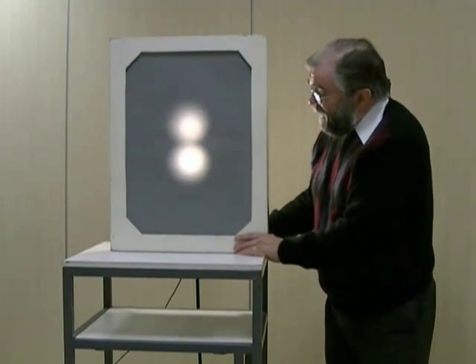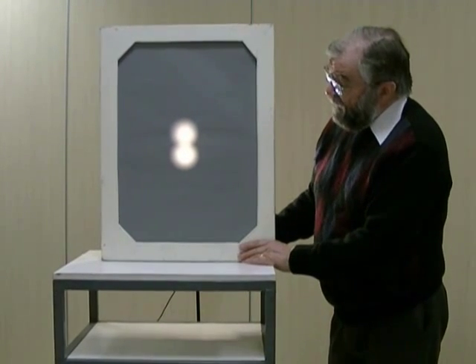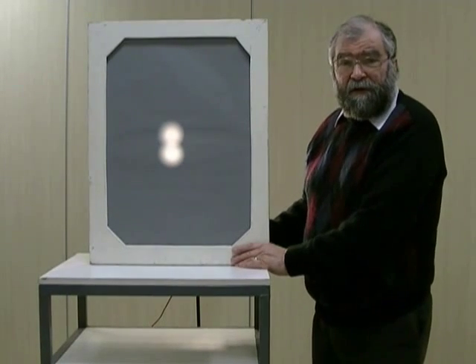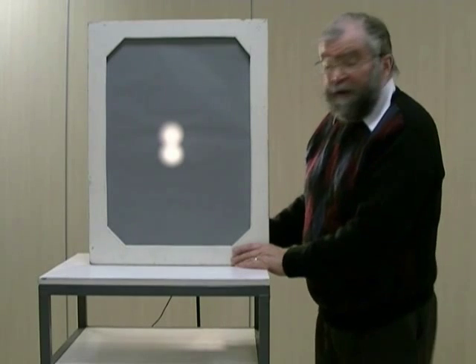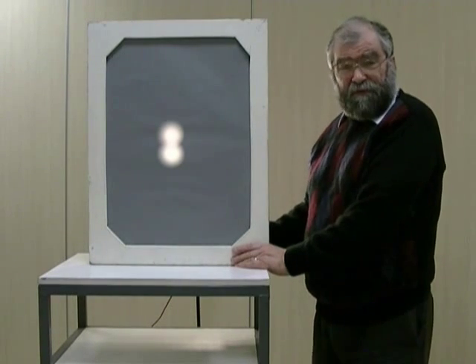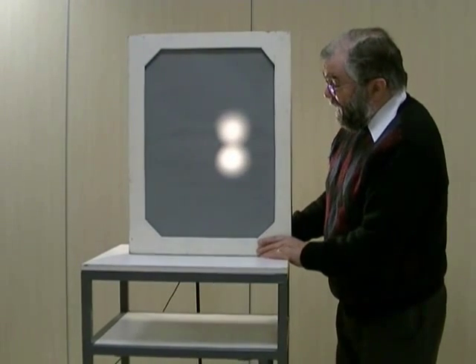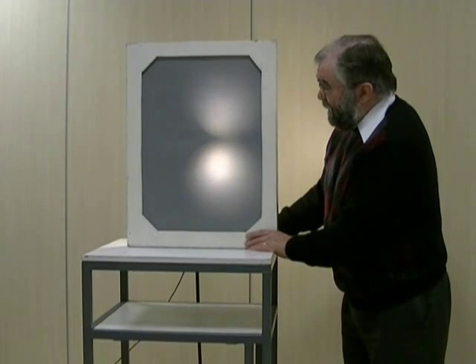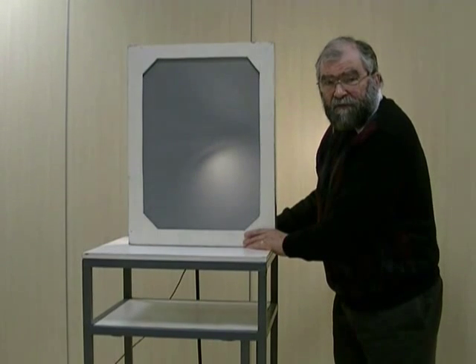Conversely, if we come further away — moving the source away from the gamma camera detector — you see that the two images get closer and closer together. Now we have a minified image. So the magnification changes with distance: when it's a long way away, you get a small image; at a certain distance, you get a life-size image; and when you're closer, you get a magnified image. But if we go too close, the magnification becomes so great that the image falls off the edge of the detector, which is obviously not desirable.